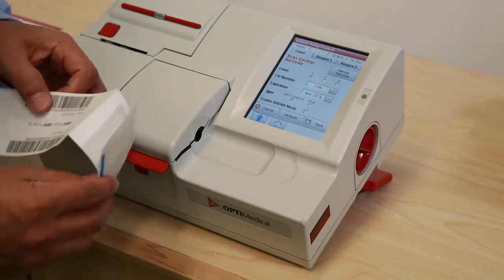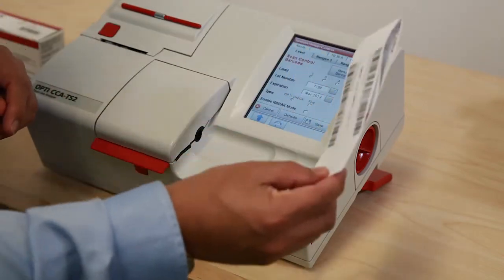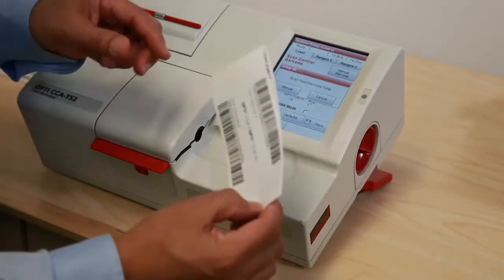The following barcode is selected and scanned into the analyzer. The instrument then prompts to scan the next barcode.